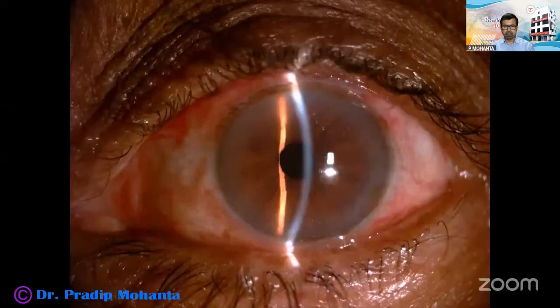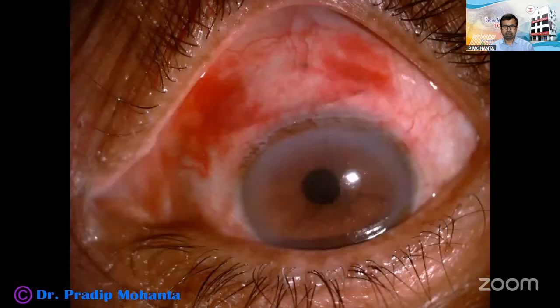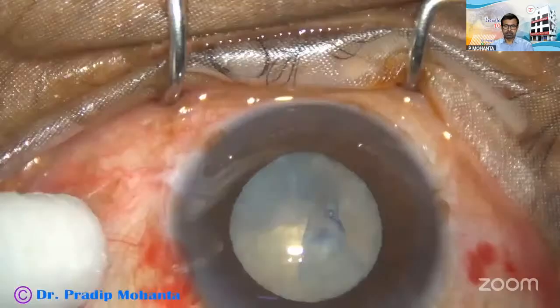No corneal edema, anterior chamber quiet. There is very nice apposition of the conjunctiva to the limbus, and the patient gets 6/12 vision unaided.